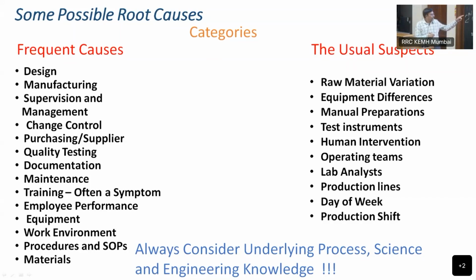So if I will opt for first type of equipment, wherein he is sending the sample immediately after sucking, say maybe more amount than required, but putting into another, say T3 T4 TSH करना है उसे, तो T3 करेगा incubation के लिए डालेगा, फिर separate करेगा T3 के लिए डालेगा, फिर TSH के लिए डालेगा. इससे अच्छा है कि he will suck all the volumes together for all the three assays and throw the tube back outside, so that it will be picked up and put it in for photometry also. Just like Rajesh sir has given an example.